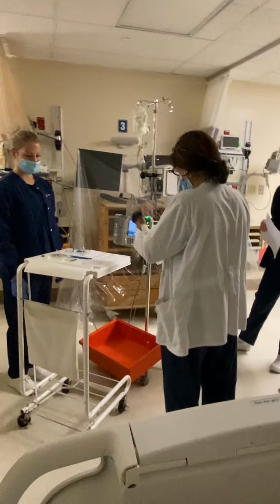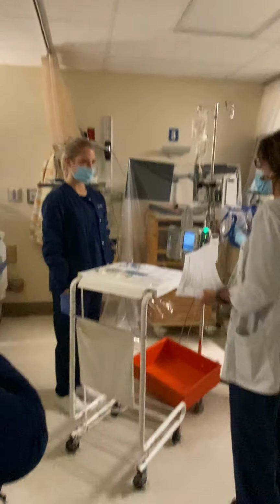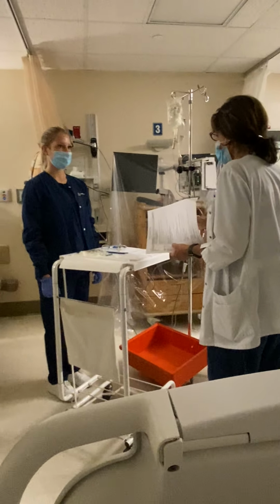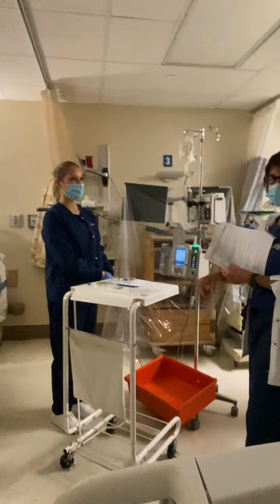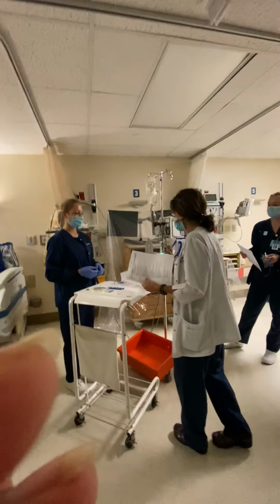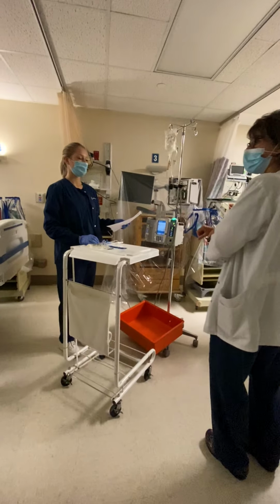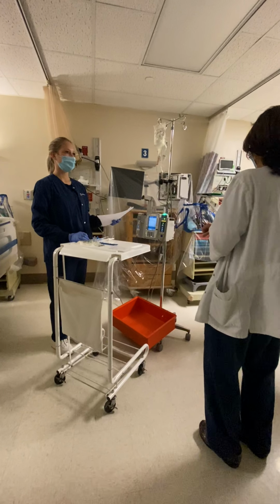Okay, so now you already introduced yourself, you washed your hands, and you're ready to check your 6 rights in the patient's room. So again, this patient is going to have an ID bracelet on. So you will need to actually take your MAR and verify it to the bracelet. Okay, so here's where you're gonna check your 6 rights.